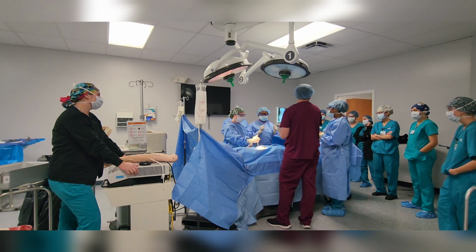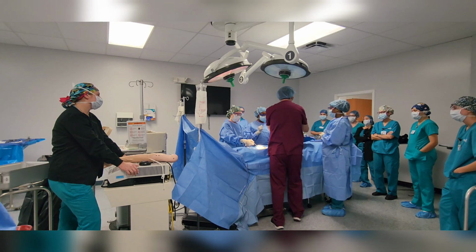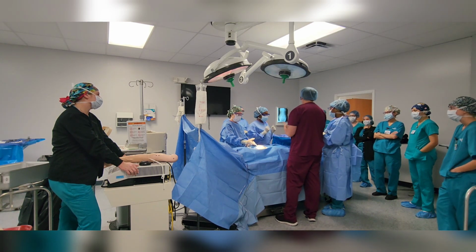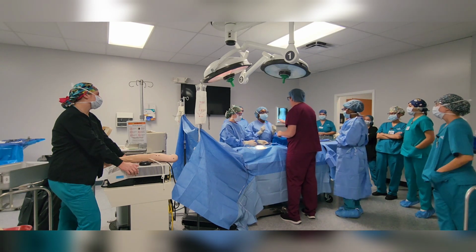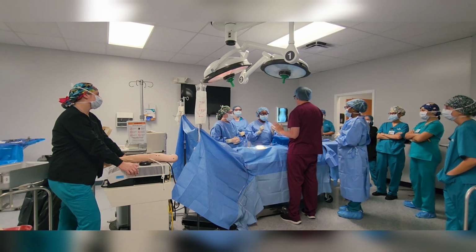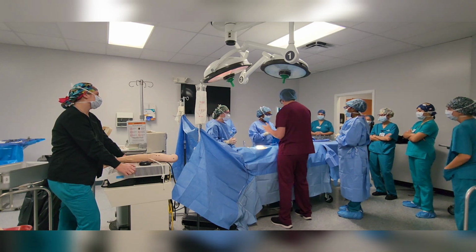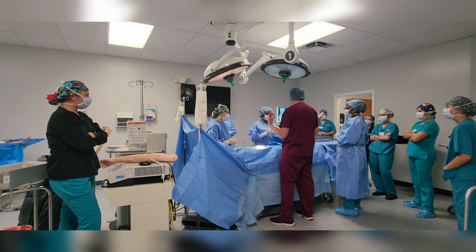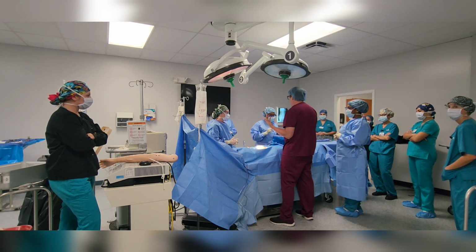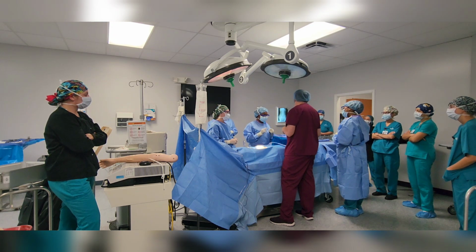Organize chaos during the process. This is your thing as it's coming down. Keep it wherever it starts. I'm so anal retentive. If I was working with you and suddenly you're looking around, moving stuff, I would be like, I don't touch my mayo or the world will end. The reason is because if it's over here, let's say we put it over there and I normally live over here, I don't care if it's obvious, I'm in tunnel vision land. I'm like, yep, it was here a minute ago. And doctors then notice that. So you become very anal retentive.